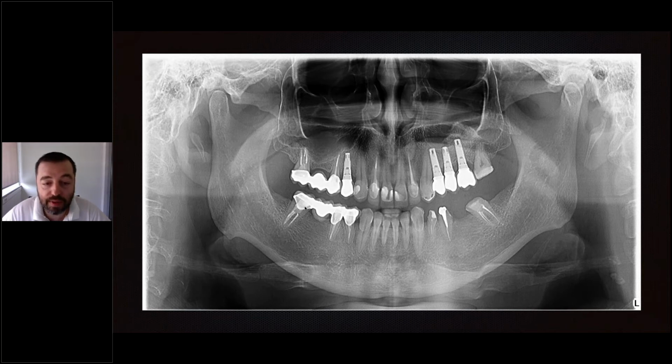We remain with the same situation, and teeth retreated in this quadrant, and here we postponed a little bit the treatment, but due to the change of VDO and the entire design of the teeth, we decided to take out the old bridge and put a provisional one with a correct design. So it was like, let's say, a small compromise for postponing this part of the treatment.